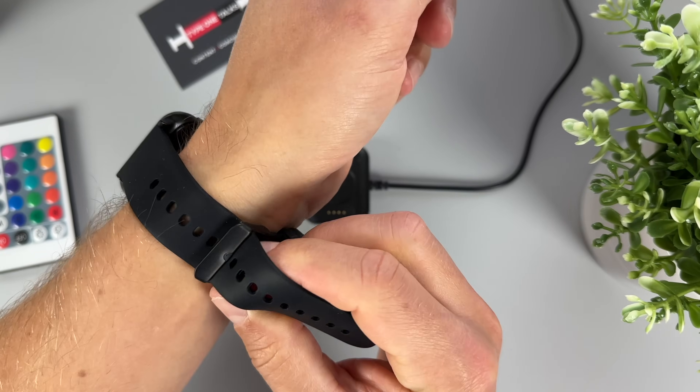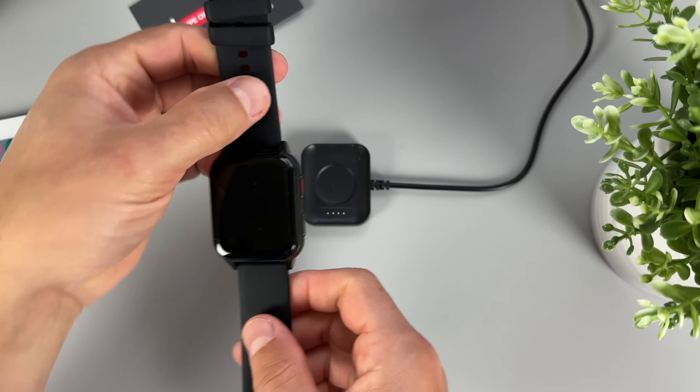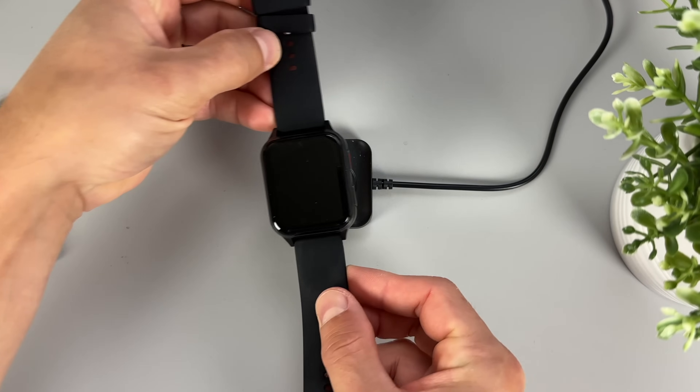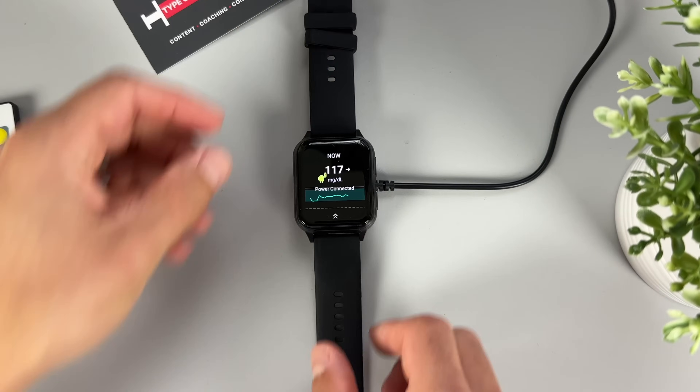The battery in the watch lasts about 24 hours and you need to charge it daily. I don't use the watch when I sleep, so I just put it on the charger when I go to bed and it charges overnight. Theoretically you could leave the watch on when you sleep, but then you would still need to take it off pretty much every day to charge it for at least an hour. What's cool about the system is that you don't need a dedicated SIM card — the sensor connects to the watch directly via Bluetooth, so you don't need to be online to see the glucose readings.